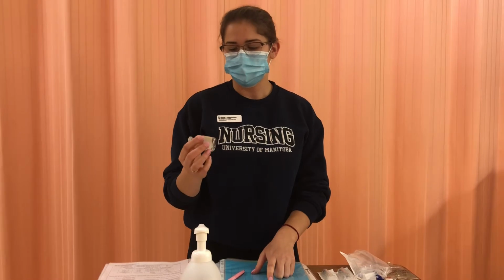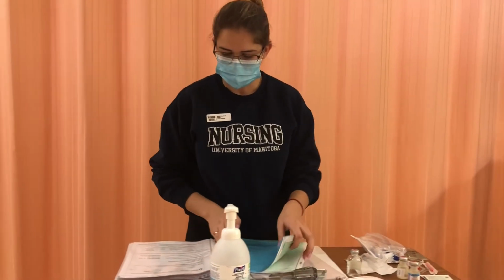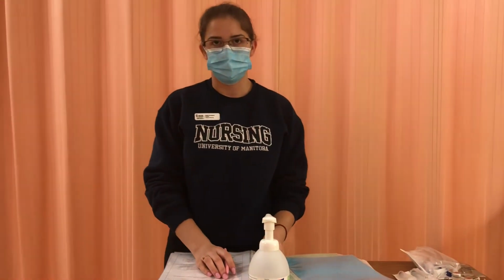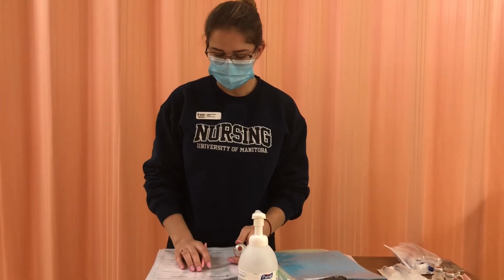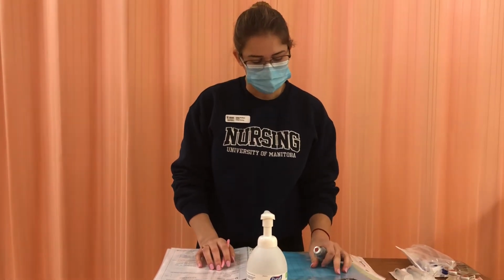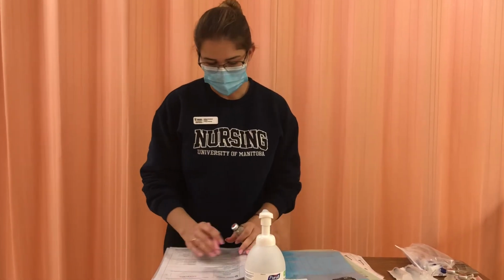I'm checking my bottle to make sure that it's not expired, and it's not, so I'm good to prepare this drug. I'm first going to check over my information in my PDM. My drug is cloxacillin. It's an antibiotic drug, which is indicated for my patient's bacterial infection, cellulitis from her cat scratch. It may be administered by a student nurse, so I'm okay to give it. The usual dose is 1 to 2 grams IV or IM every 4 to 6 hours. So we're a little bit below that, but that's okay. The maximum single dose is 2 grams, and we're well below that, so that's good.